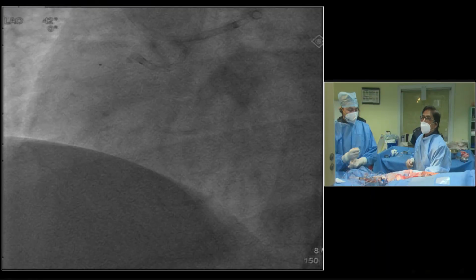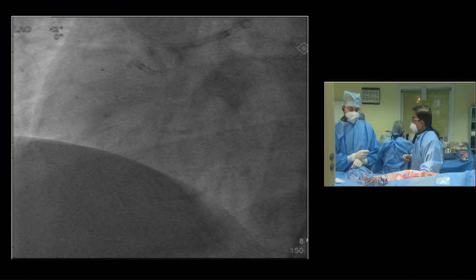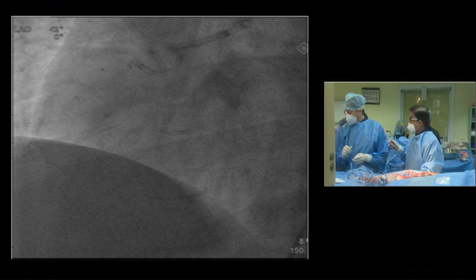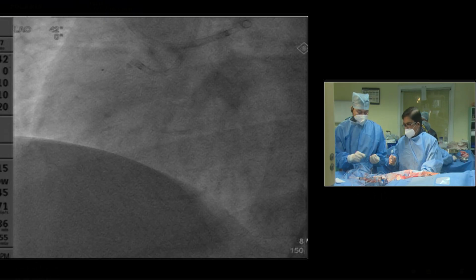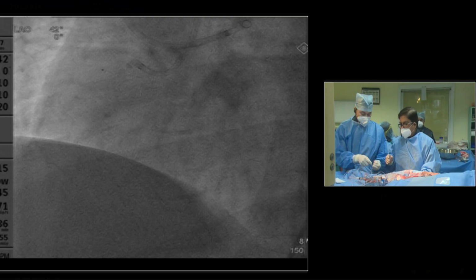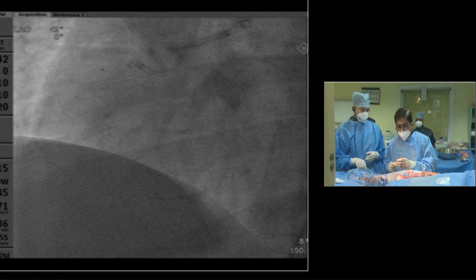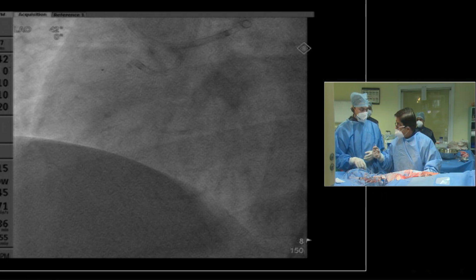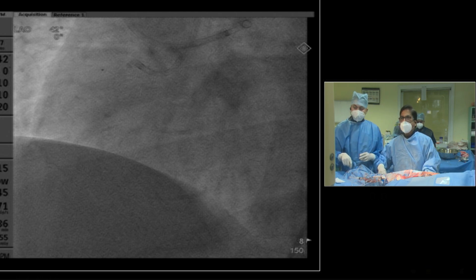Yeah. Dr. Goel, there is a question actually. Anytime you use an AR catheter? I don't use it, but what is your opinion? Well, AR, sometimes if the SAL is becoming too big for that aorta, then AR2 or AR1 could also work. But what we need is an Amplatz type of curve, and regular AL is too big for a right coronary, that is sure. So SAL works largely. This is Gaia 2? Gaia 2. New York? New York. Okay. When the angulation is very good for a JR catheter, SAL will work very nicely.